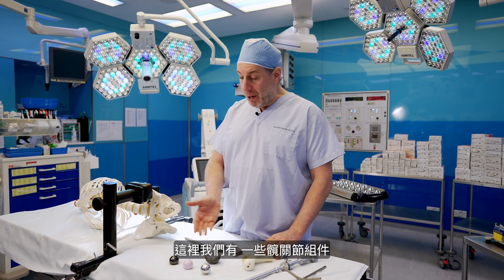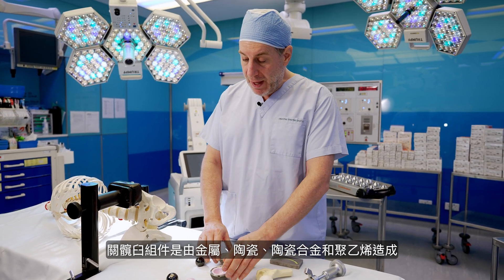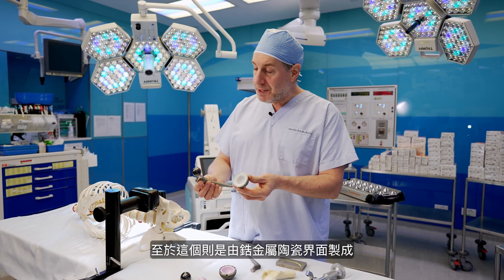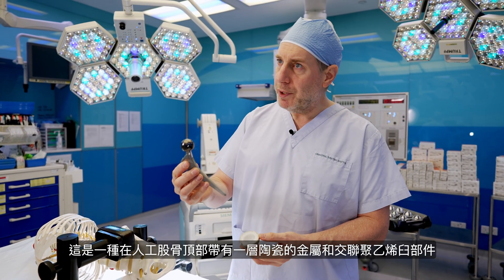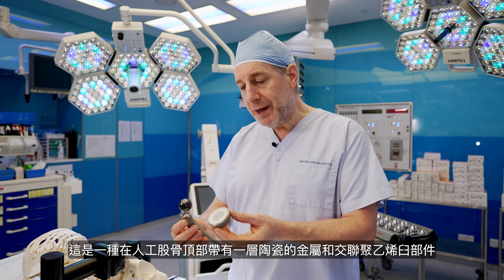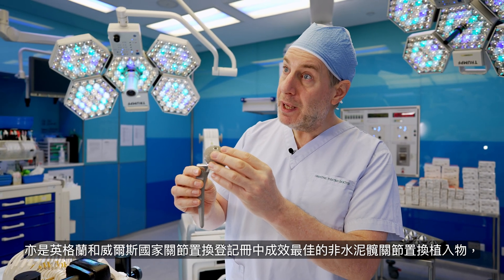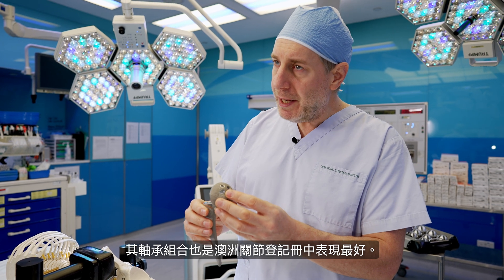We have a number of bearing materials: metal, ceramic and ceramicized metal, and ceramic and polyethylene acetabular components. In particular, this combination of an oxidized zirconium — a metal with a layer of ceramic on top — femoral head, together with a cross-linked polyethylene socket component. This is the best performing cementless total hip replacement in the National Joint Register for England and Wales, and this bearing combination is the best performing in the Australian Joint Registry.